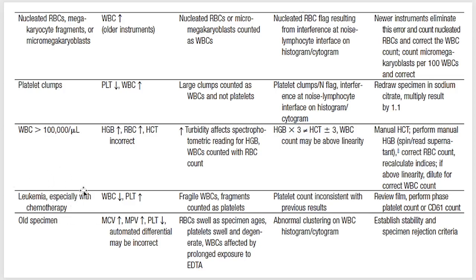That's why, kahit sa mga ganitong mga parameters sa ating patient, we have to really know the diagnosis of our patient. Kasi usually nga sa mga requests sa mga inpatient, meron nakalagay na diagnosis and you will be guided with your results. That's why if there's something abnormal or not correct with the CBC results na print ng ating machine, you have to really investigate.